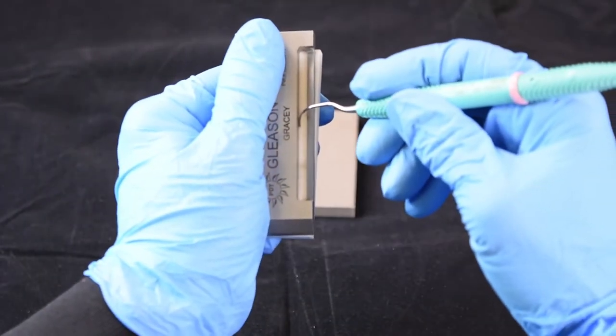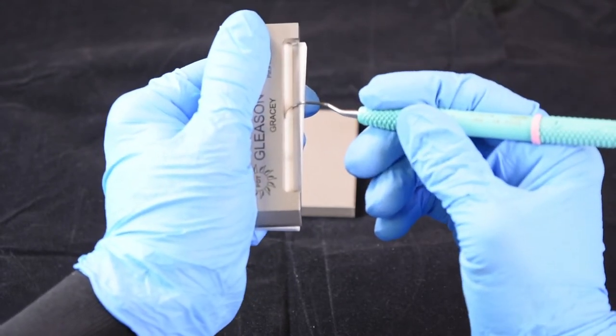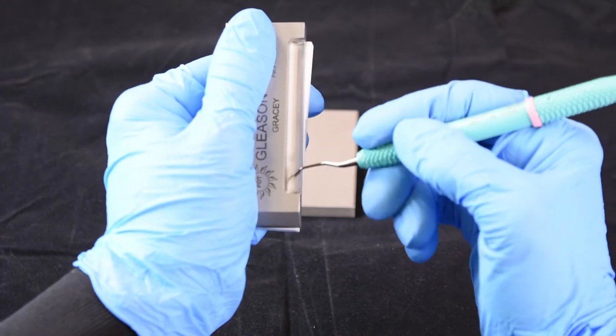Place the back of the blade against the stop, bring the terminal shank down to the rest, and glide.